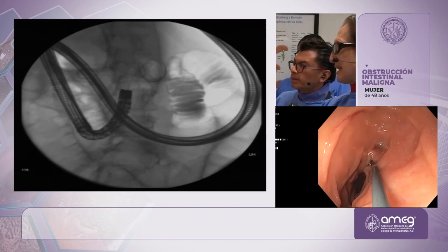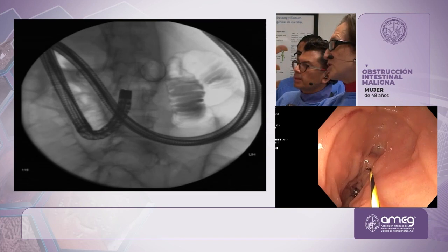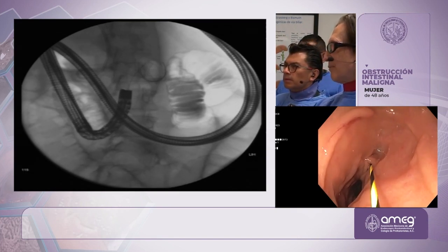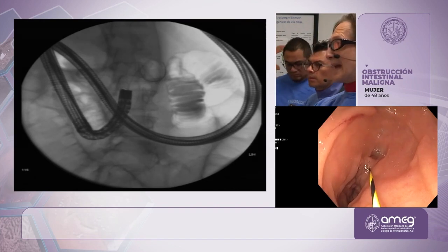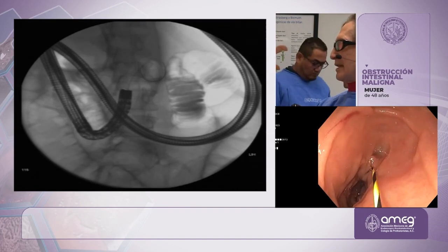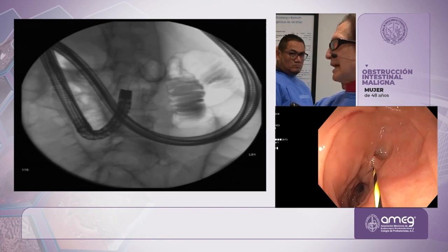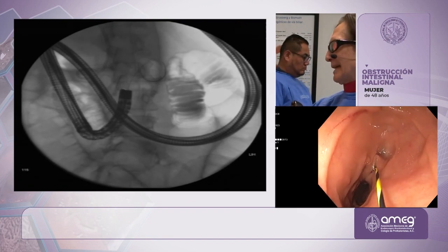So advance, please, as I pull back. See, there's the jag wire, right? Okay, you just watch that wire. Make sure that the stripes don't move back or don't move forward. There's no need to use fluoro now. There's no additional information you're getting.